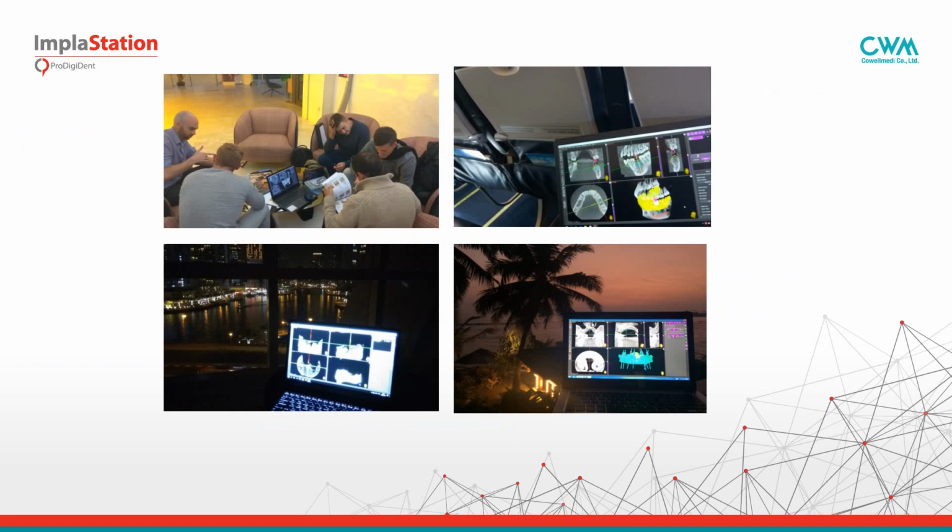These pictures are just a part of those sent to us by our users from their trips, rest and vacations. Thanks to digital technologies, it's possible to send comprehensive information about a case anywhere and very quickly. The core competency of the implantologist is not manual skill, it's mental skills and experience to assess a case and take a proper decision.